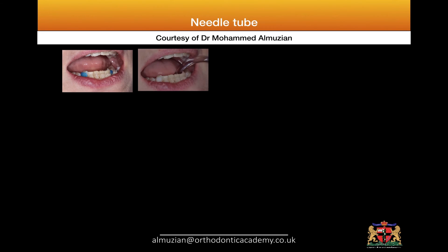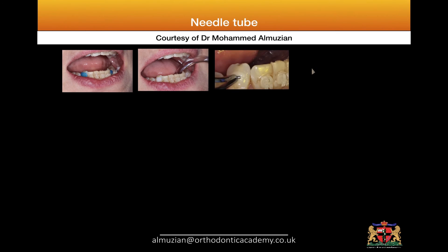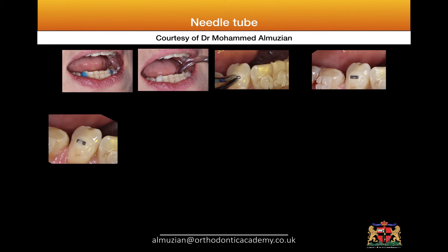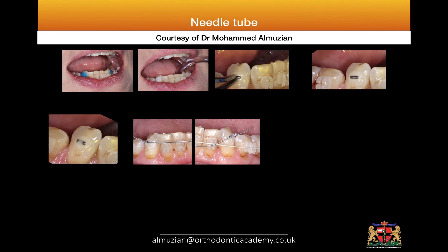I etched the surface, isolated the tooth, placed a bonding non-filled resin, then applied flowable composite, placed the modified tube, secured it in place, and added additional flowable composite on top and cured it. After that I placed a main arch wire — in this case 16x22 stainless steel coated arch wire — with a piggyback wire of 0.012 nickel titanium.